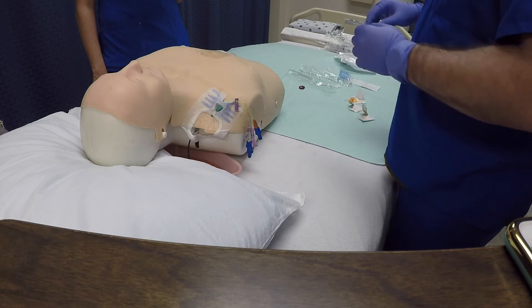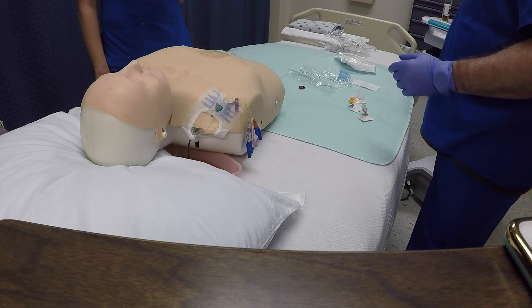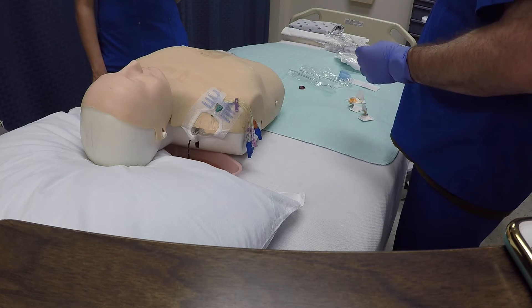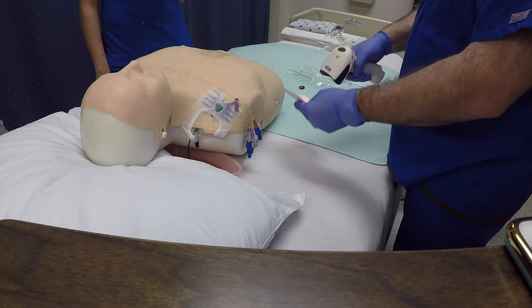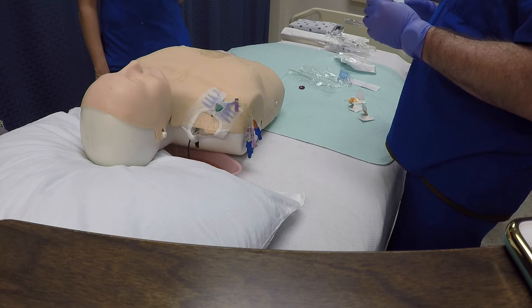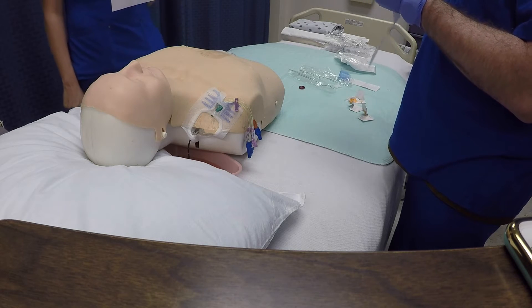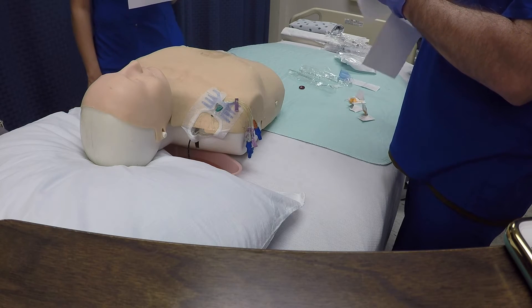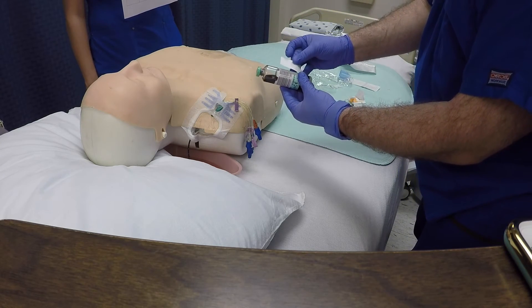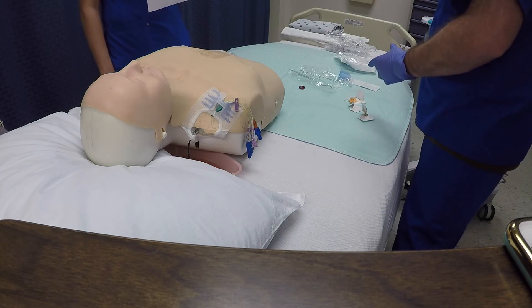Important step number six is scan and label. Key point number one is to do it at the bedside, and the reason for that is so you have the correct patient with the correct armband. Key point number two is to place the label over the white label, and the reason for that is so you don't cover the barcode — so that the lab will be able to scan the barcode.